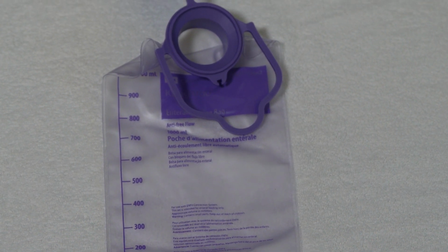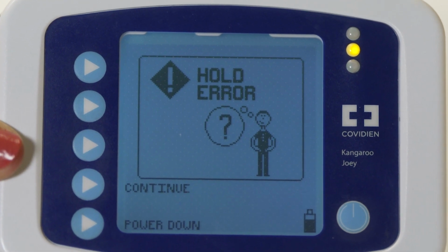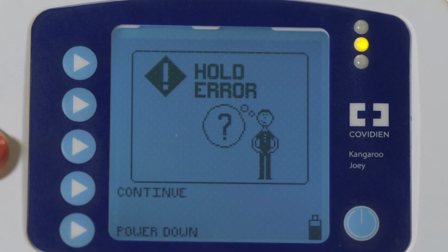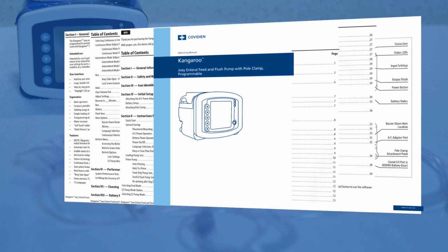If you hear or see any alarms or error messages on the pump, follow the instructions on the pump screen. You may also use the instruction manual you received to help clear alarms.